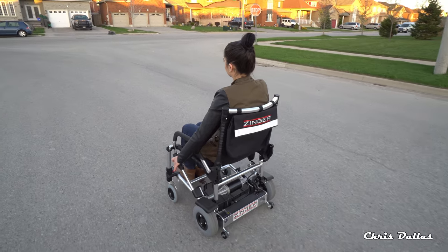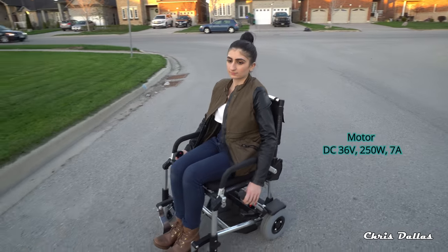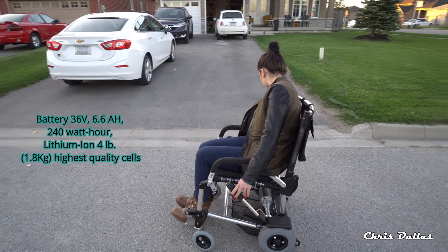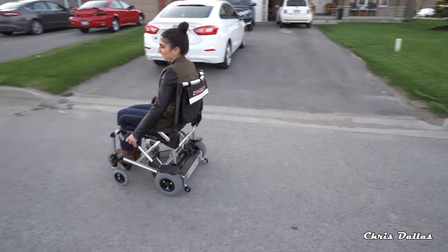For somebody who does not like the traditional wheelchair with a thumb stick, you can utilize the Zinger chair. In my opinion, it looks a lot better. It does not look like a wheelchair. For anybody really, if you look at it, it's a beautiful match chair.